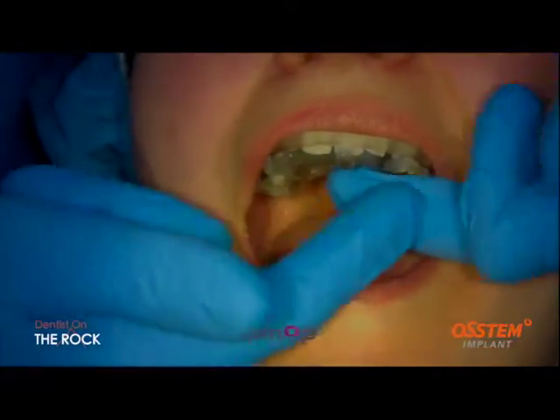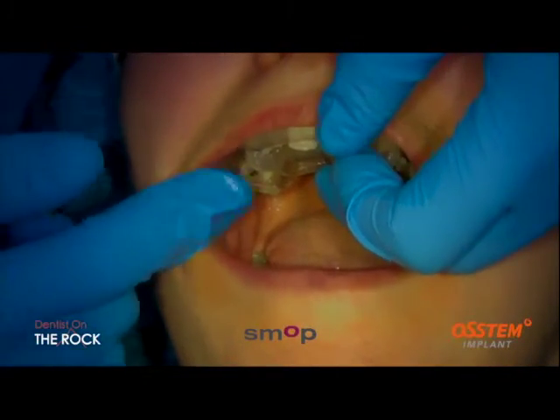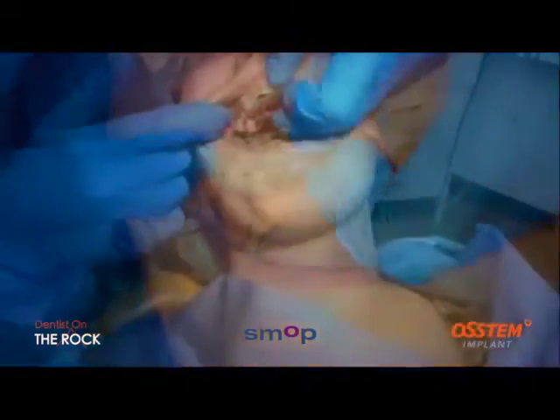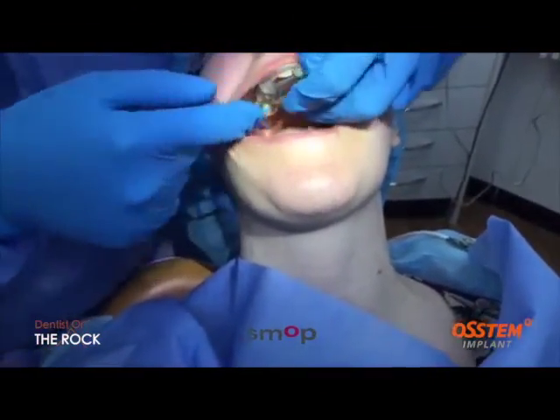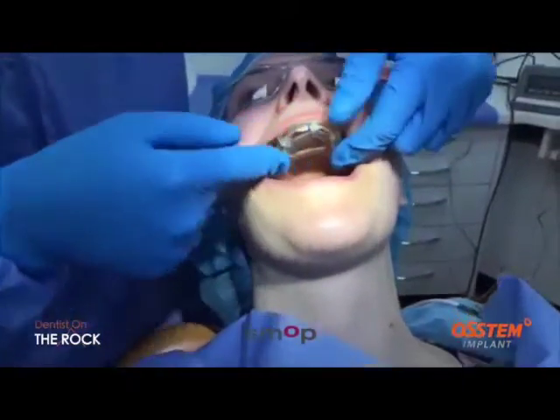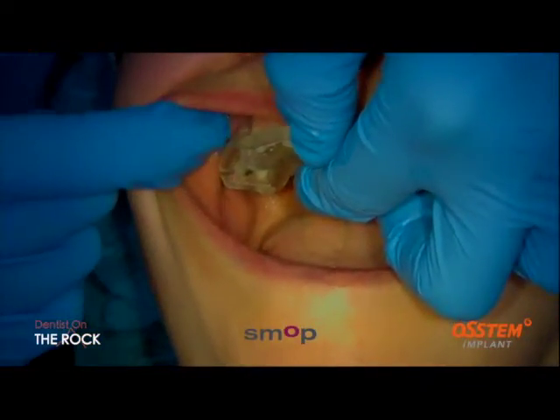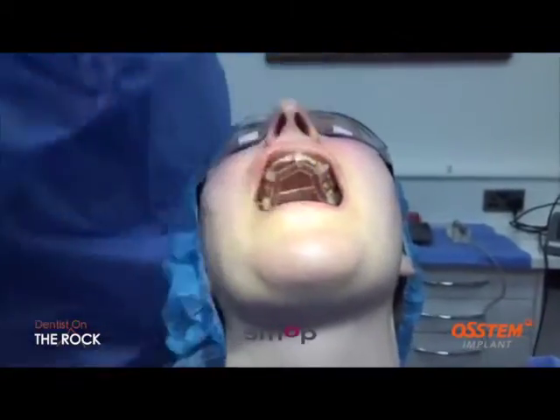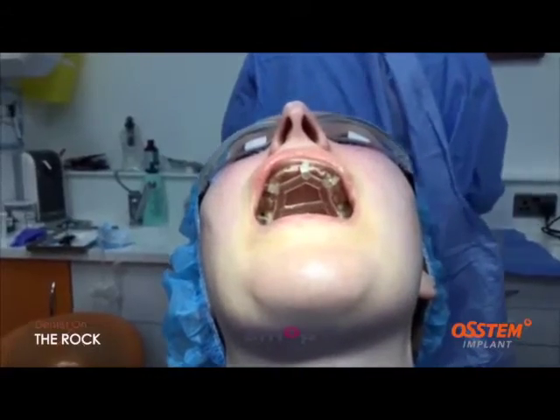And if it's resting on all of those different parts, then I know that the fit is accurate, and I know that the guide is going to be accurate for where I'm going to be drilling here. When I'm doing the drilling now, I'm going to be taking this in and out a few times, and that's one of the other reasons why I don't want to engage in the undercuts too much. But that's my personal preference, and like Florian said, the SMOP guide can be very easily adapted to suit how you like to work. So the first thing we're going to do, we're going to do the tissue punch.